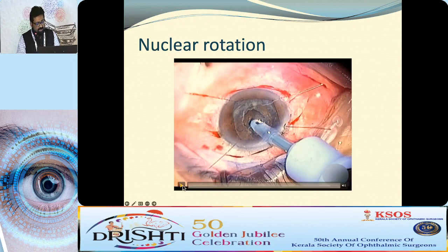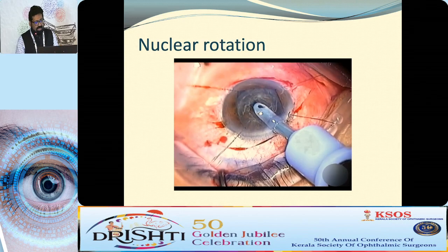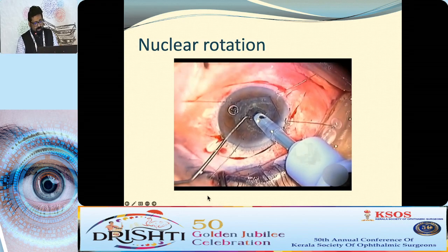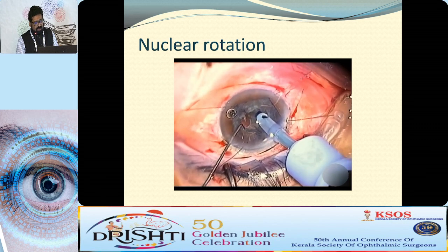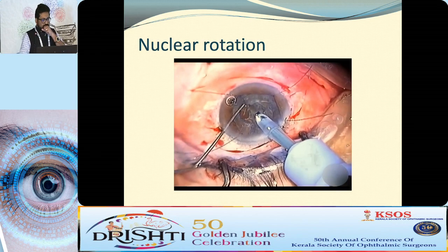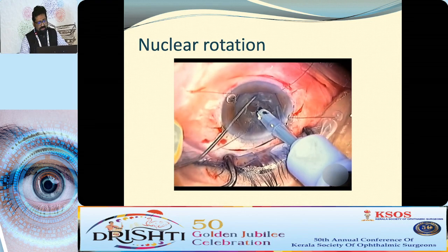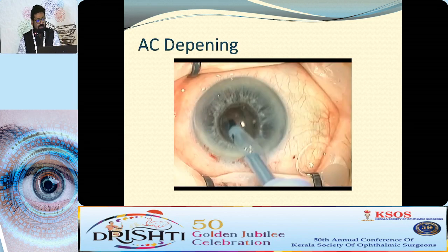So this is one such situation in which the surgeon is making a trench, and then he has a doubt whether he's caused a PC rent. So he tries to separate, and then he sees a suspicious PC rent there. When he tries to rotate, see, rotating and the pieces just bouncing back. This is a very important step, indication that there could be a PC rent.